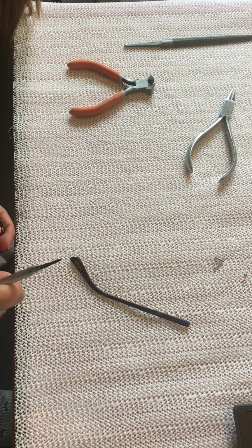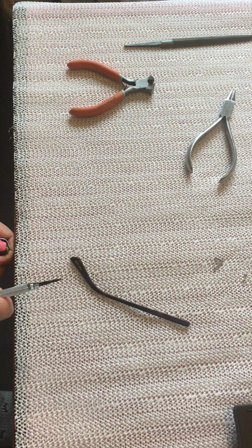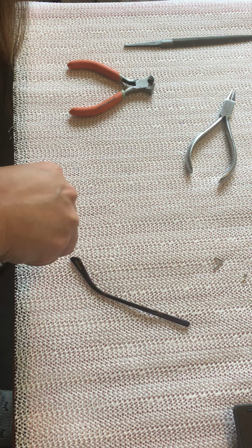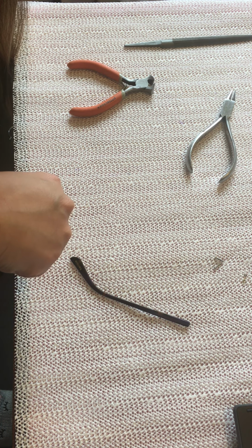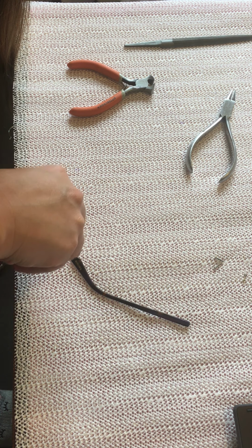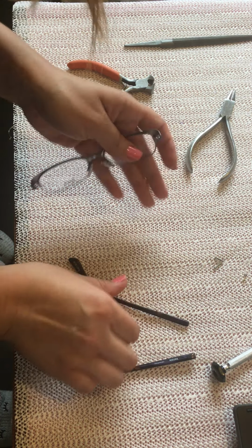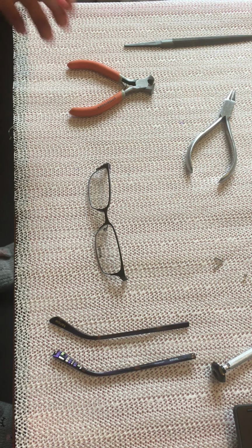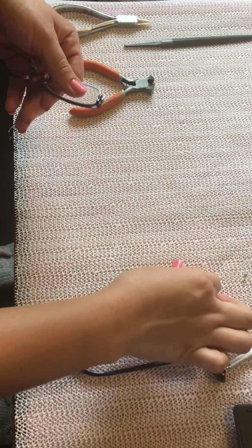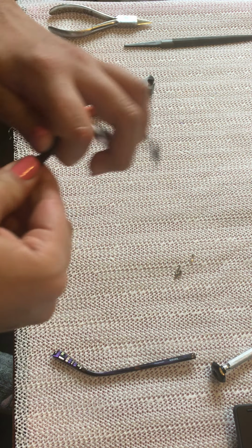I'm going to be using my nail to push it a little bit out. So I'm going to be pushing it out like that to help me remove the screw, that way the actual screw doesn't go back in. Okay, now it's out. So now we have both of them off. Here we have our nut and our bolts. Okay, so I'm gonna start working on one side.